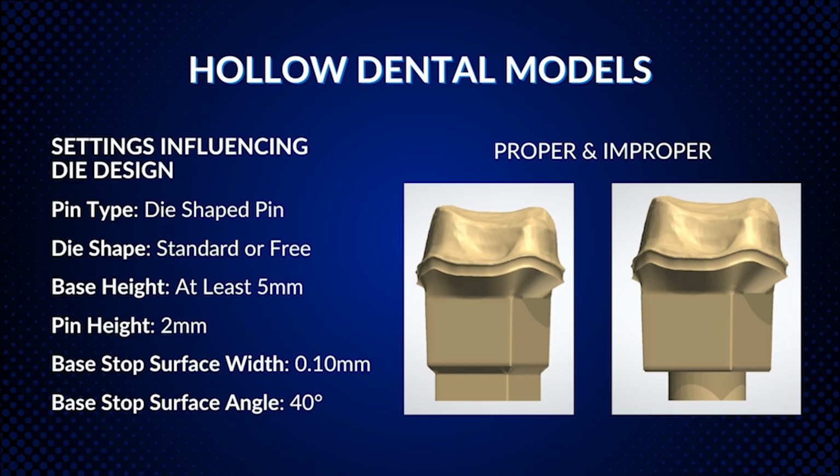On the left, you'll see I have a nice flat surface on the bottom of the die. You'll often see the one on the right when you do have a removable die situation. I'm sure you all know, with analog, we used to use our tools to pop the bottom, to raise the die out of the model. I like to use the one on the left to have that nice flat surface, again, avoiding supports. Now, there are lower anteriors and things like that we do need to kick to the side a little bit and support, and that works properly. That's great, that's what we need because the footprint isn't large enough to keep that adhesion on the build platform.